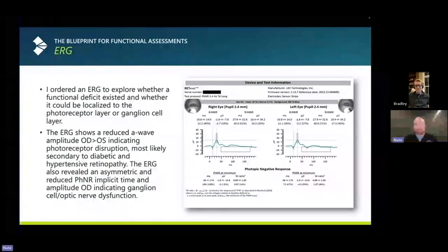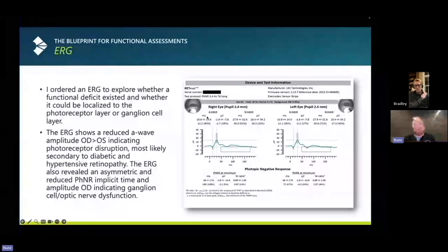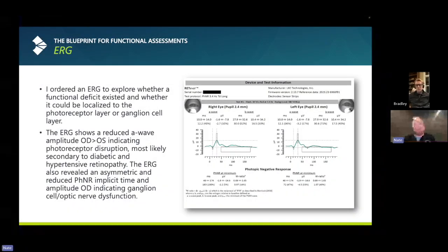Yeah, I don't dive that deep on this one. When I'm looking at the photopic negative response, it is the W ratio which I look at, 11% or less being abnormal, and then the B wave latency or implicit time at 89% or higher being abnormal. Again, remember that you don't want a high percentage in the 100-yard dash. You want a low percentage. So as this number is creeping up, 89% or above is abnormal for the B wave. For the A wave, I would kick that to April or Dr. Grant. Again, A wave is photoreceptors. That's what the A wave is, from the photoreceptor. So I'm not looking at that in terms of glaucoma, because that's ganglion cells.